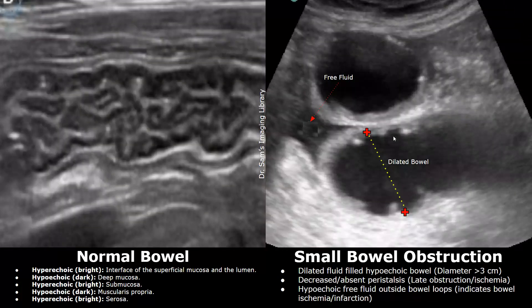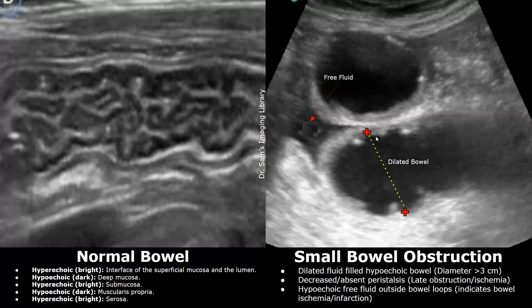This is another image showing normal bowel — you can see its various layers clearly. In the image on the right we have a dilated fluid-filled hypoechoic bowel in a case of small bowel obstruction. Peristalsis was absent in this case.